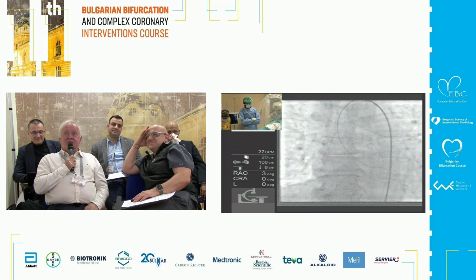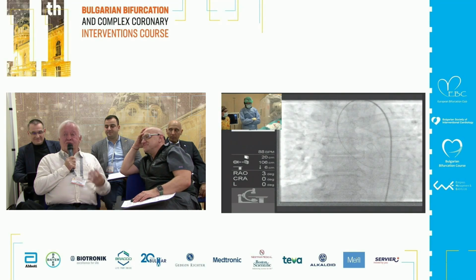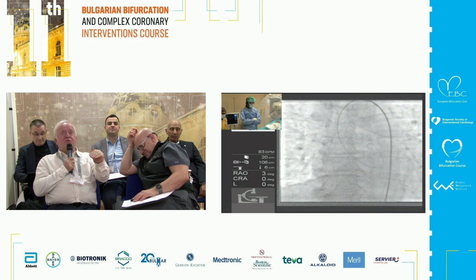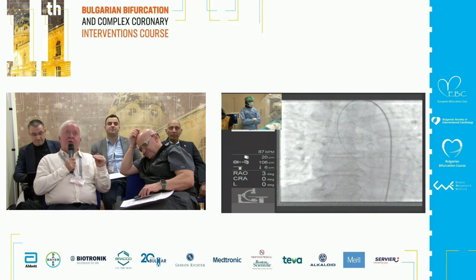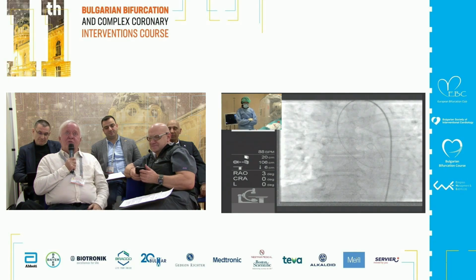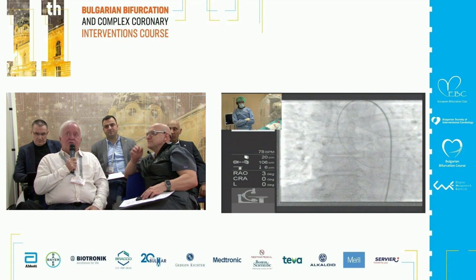The only catheter I will never use, because I consider it a mistake, is an Amplatz, because Amplatz is either deeply inside or completely out. It's difficult to manage when you are exchanging your wires, and the risk is a jump of the Amplatz damaging the stenting. So very clearly for me it will be 6 French and EBU.